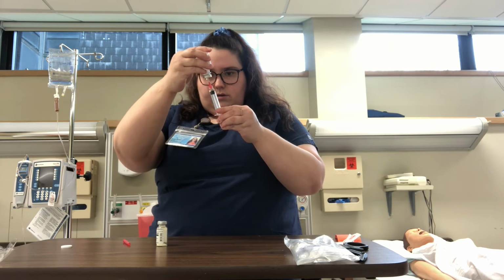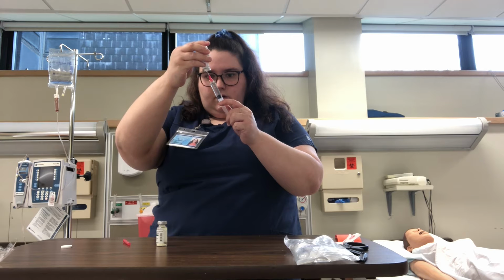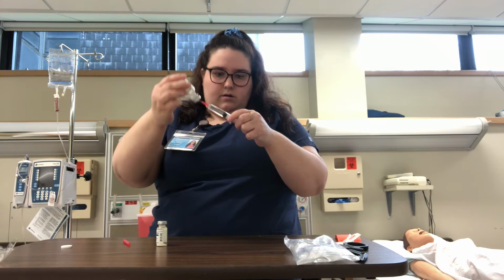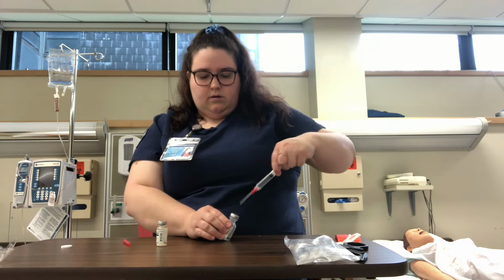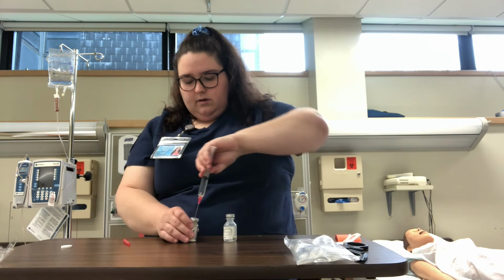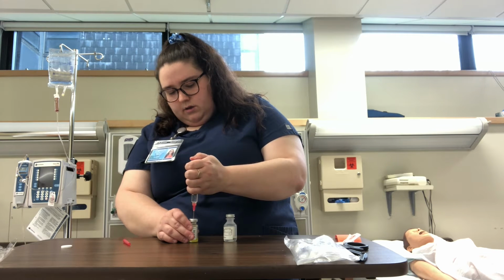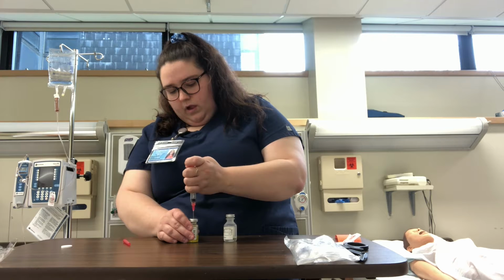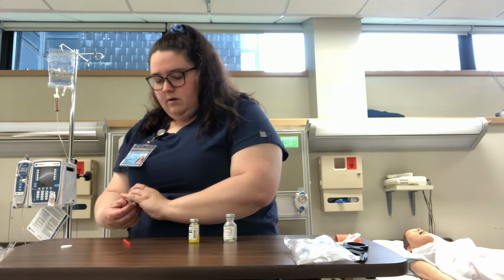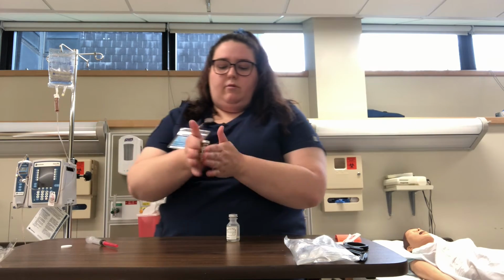And then take out 5 cc's. I'm going to inject those 5 cc's to my powder. Recap my needle until I need it again. And I'm going to agitate this until all the powder's dissolved.